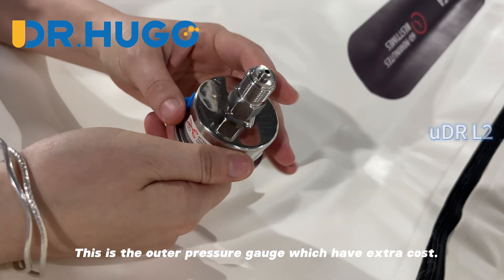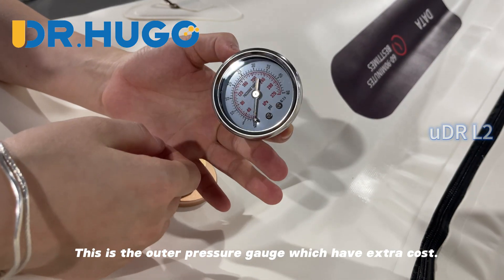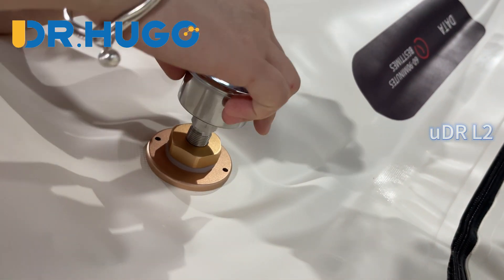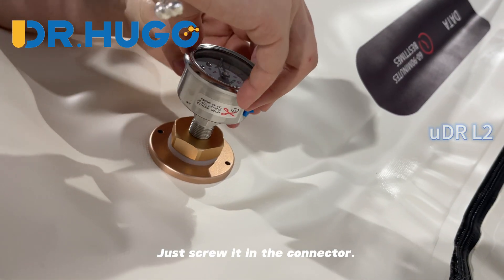This is the outer pressure gauge, which has an extra cost. Just screw it into the connector.